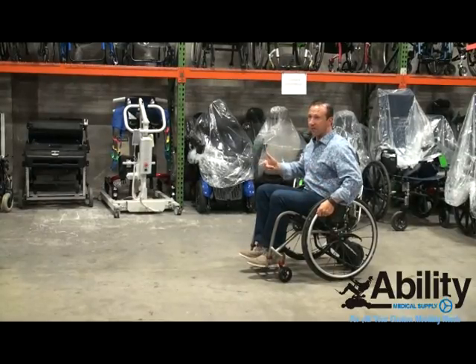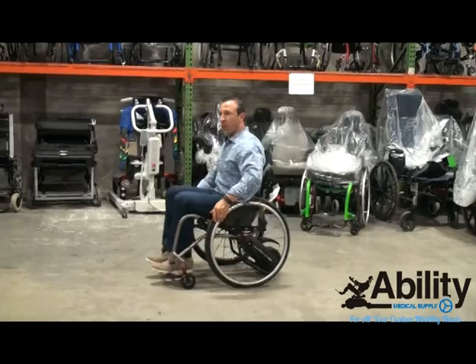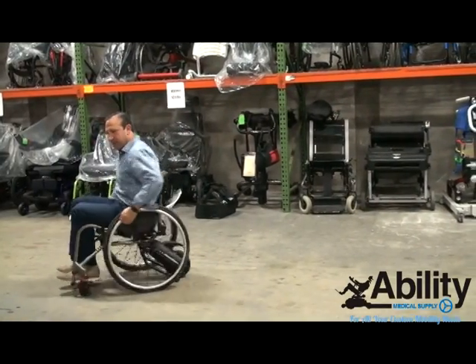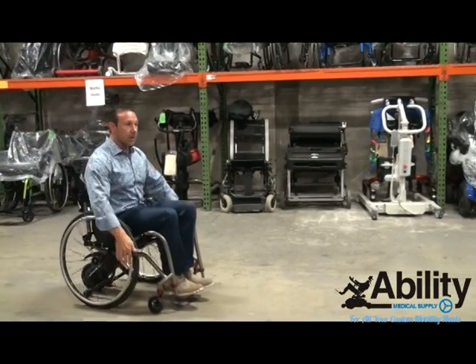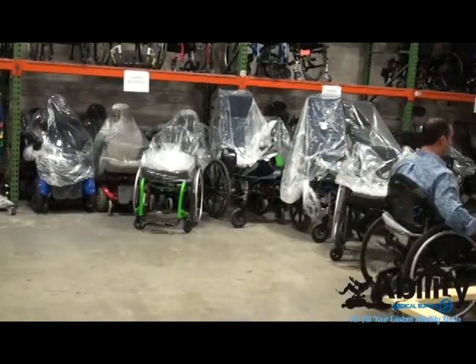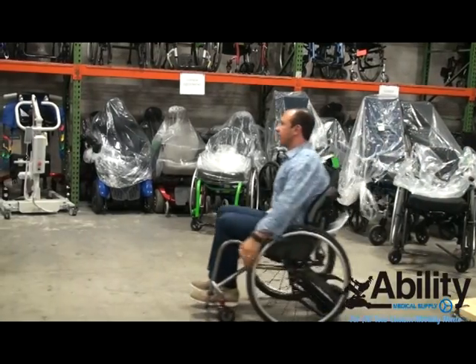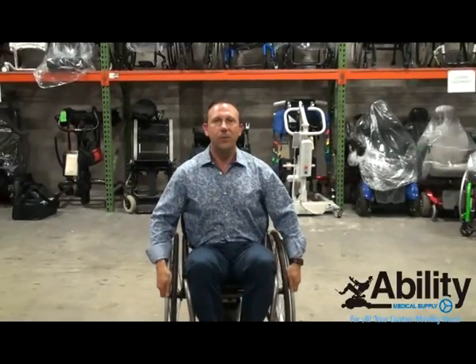It will take you through grass, gravel, pretty much anywhere, aside from snow. So once again, I'll show you one push — the unit goes all on its own. Then I can stop it. If I push the unit once and then twice, it goes really fast. This is the SmartDrive by Maximum Mobility.